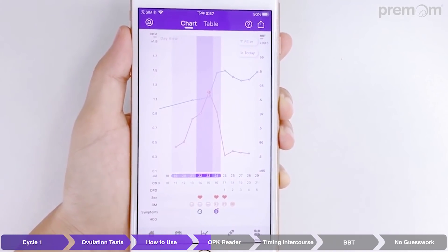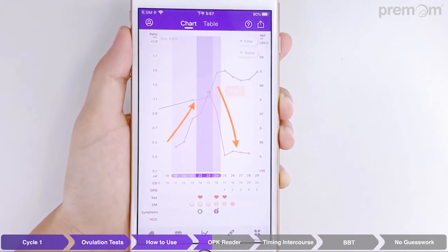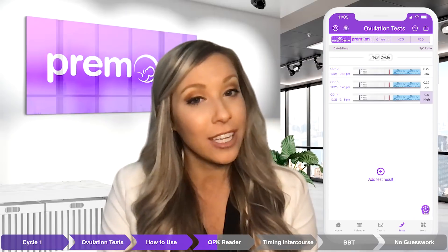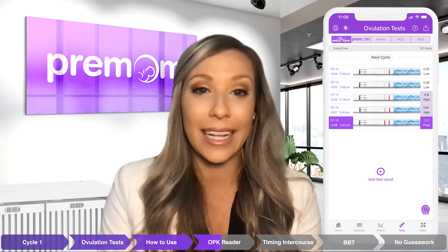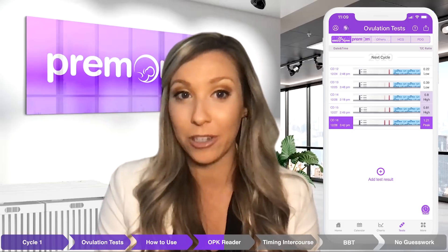The smart technology will automatically add a numerical value to the strip and plot the value accordingly in your cycle chart, allowing you to easily visualize your LH pattern. When the test line reaches its darkest level, that is considered your peak day, and it's highly likely that you'll ovulate within 24 hours. You can ensure that intercourse takes place on and before this day.